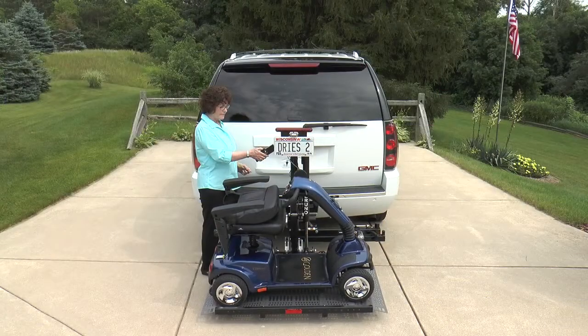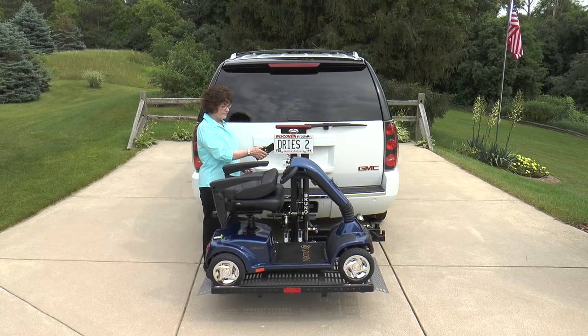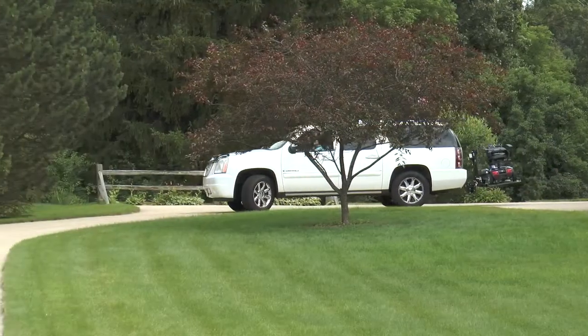Bruno's Outsider features a lifting capacity of 350 pounds or 159 kilograms. Check with your local Bruno dealer today to learn more about the Outsider.